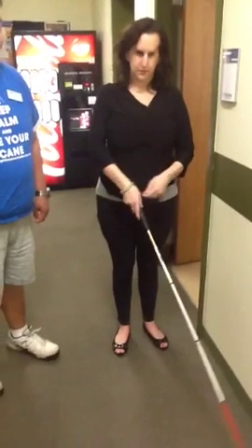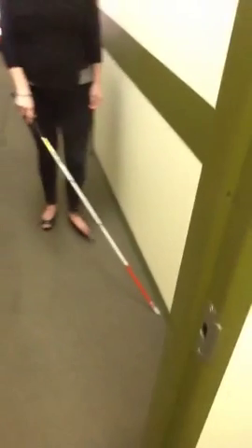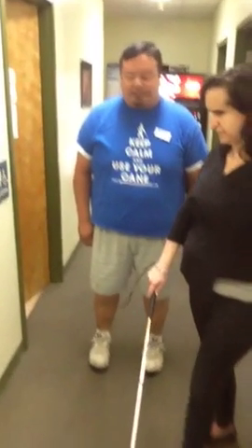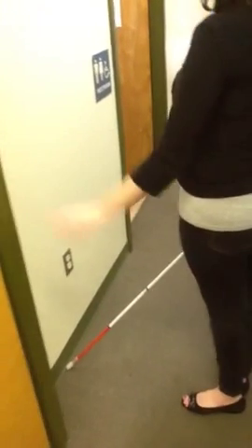Okay, we're going to go ahead and turn back around, and we're going to go the opposite direction. Go ahead and switch hands. We're going to reverse it, and let's go ahead and travel. And now I'm going to give you definition to the doors that you come by. This is the EI doorway, your early intervention. Okay, there, keep going.